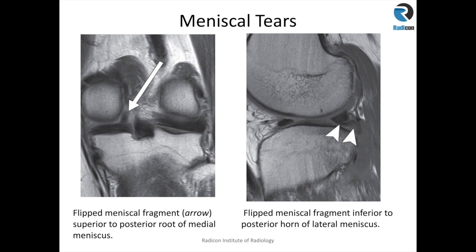In this second case, you can see a tongue-like structure protruding posterior and inferior to the posterior horn of the lateral meniscus, and there is a bit of volume loss and blunting of the posterior horn of the lateral meniscus. This indicates damage or a tear to the posterior horn of the lateral meniscus with the meniscus flap displaced posteriorly and inferiorly.